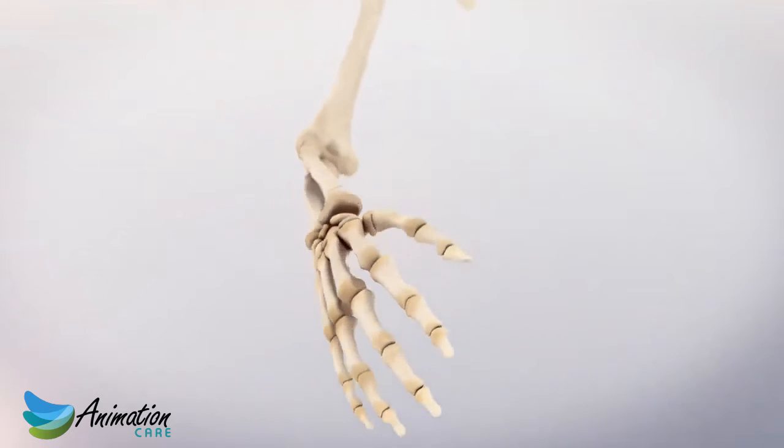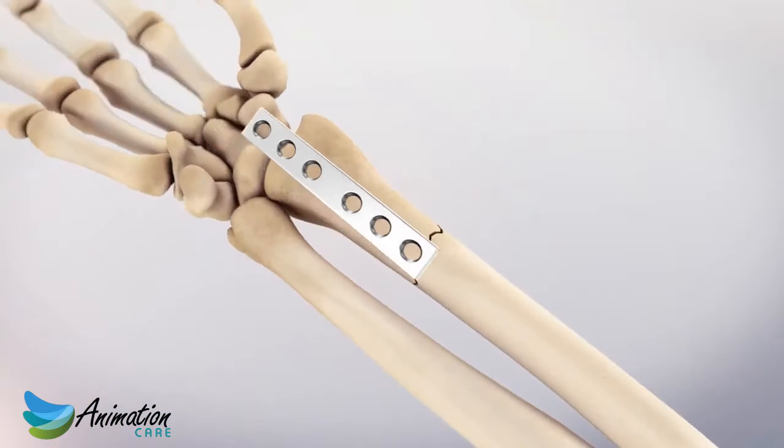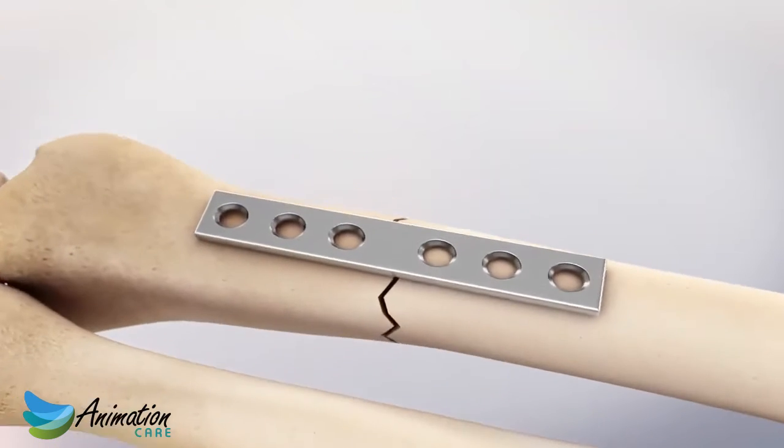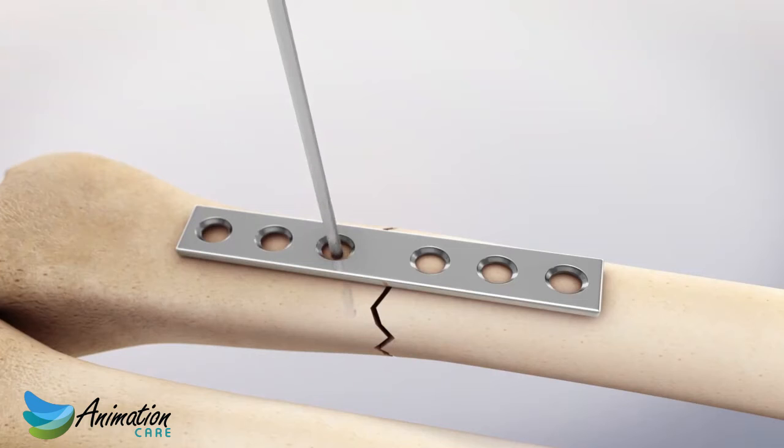When a bone fracture requires surgical intervention, often a plate is set across the fracture site. A drill is then used to create pilot holes for screws to secure the plate in place.